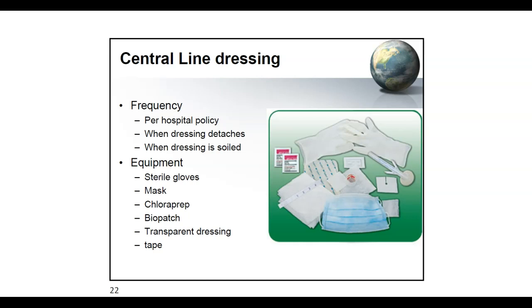Make sure that you get your equipment, which includes a sterile glove. So this is a sterile procedure, right? Because you don't want to be touching it with your regular gloves or your bare hands, because it can introduce bacteria. Make sure that you're wearing a mask when you are doing the dressing change.